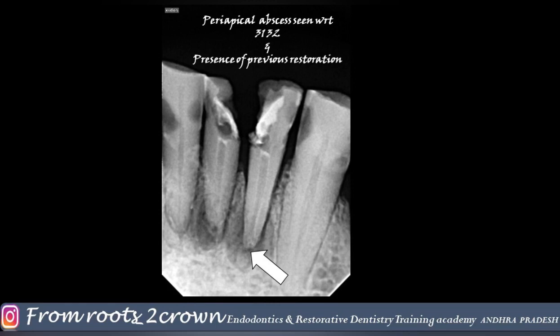Coming to the radiographic examination, it revealed a periapical radiolucency with respect to the mandibular left central incisor and lateral incisor, and a small preparation of the root canals was also observed. So we advised the patient for re-root canal therapy. Also in the radiograph, slight apical resorption was seen in the periapical region of 3.1 and 3.2, that is the mandibular left central incisor and lateral incisor.